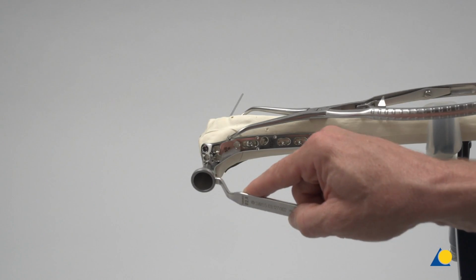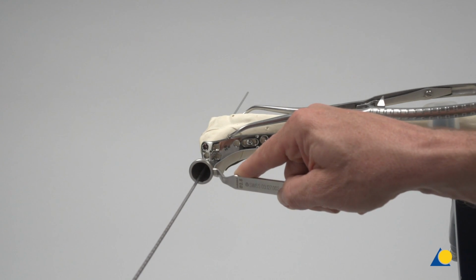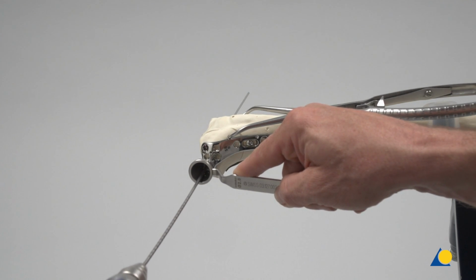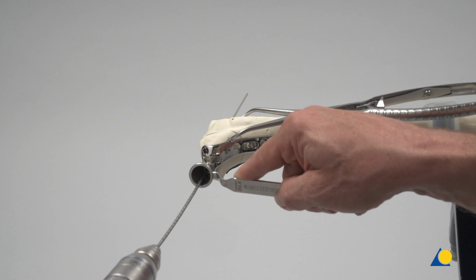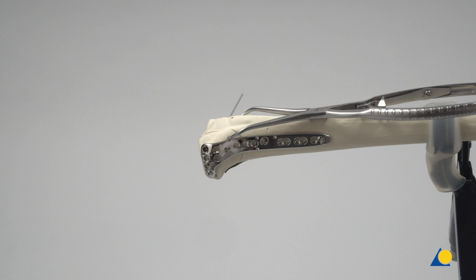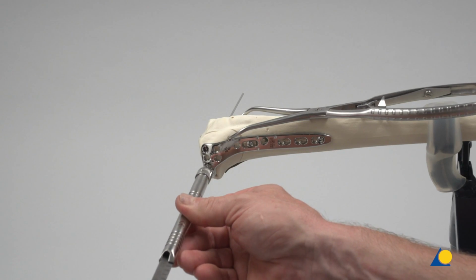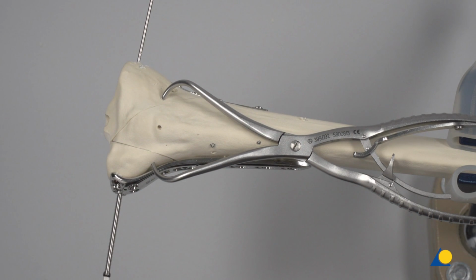The cone-shaped end of the VA double drill guide 3.5 is placed in a plate hole of the proximal rafting row. The 2.8 mm drill bit is used to drill a hole at the desired angle through to the tibial condyle. Clinically, the path of the drill bit is regularly checked under image intensification to ensure that it does not collide with any screws or penetrate the articular surface. The depth is measured, and the screw insertion steps are repeated to insert a 75 mm length 3.5 mm VA locking screw here.